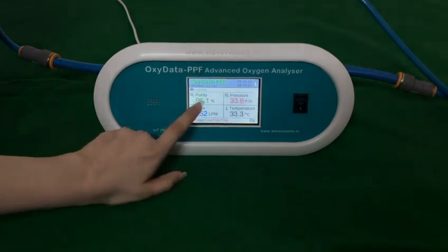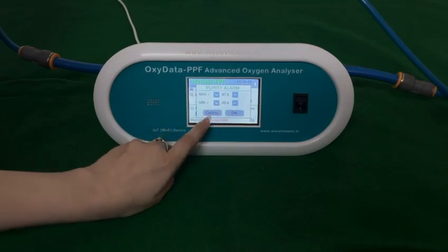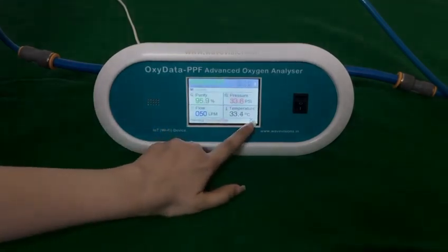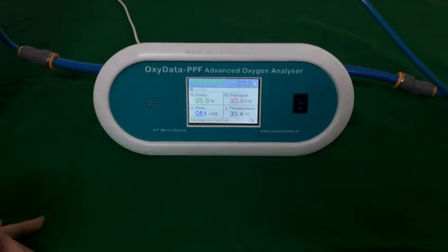You can set alarms for each parameter, maximum and minimum values. Here you can mute and unmute the alarms according to your need. This can also be seen on the Wi-Fi app.